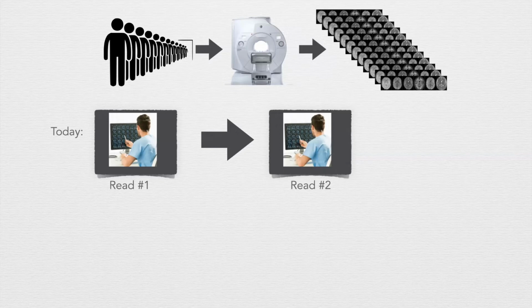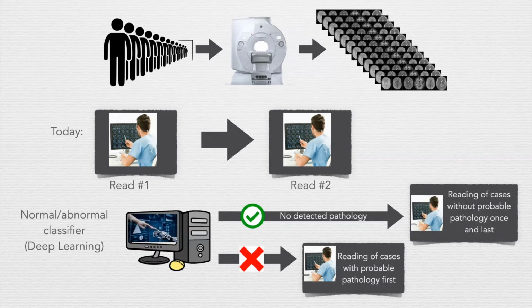So today, since Karolinska in Sweden is sort of the last resort for hard patients around the country, we have higher standards when it comes to reading the MRI images. So we always have 2 neuroradiologists that are reading them independently and confirm the diagnosis, because they can agree on what they see. And that is very time consuming, especially if you have a long list of patients.